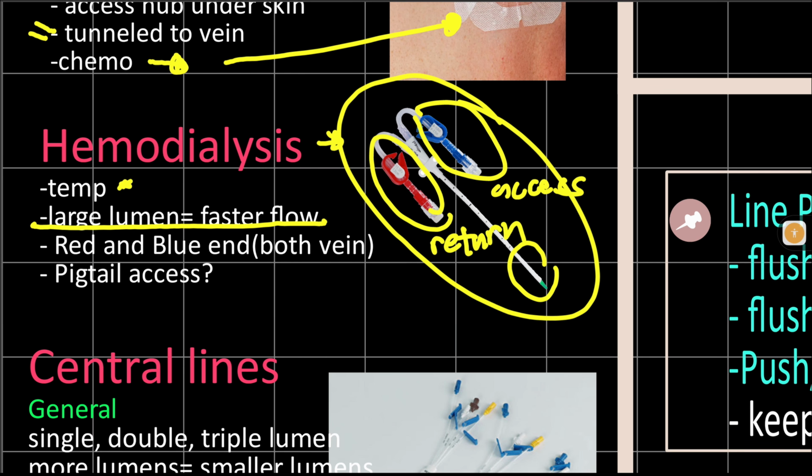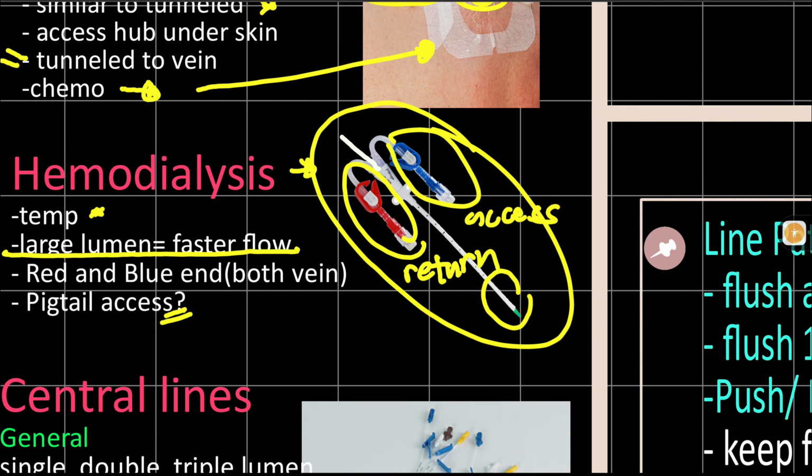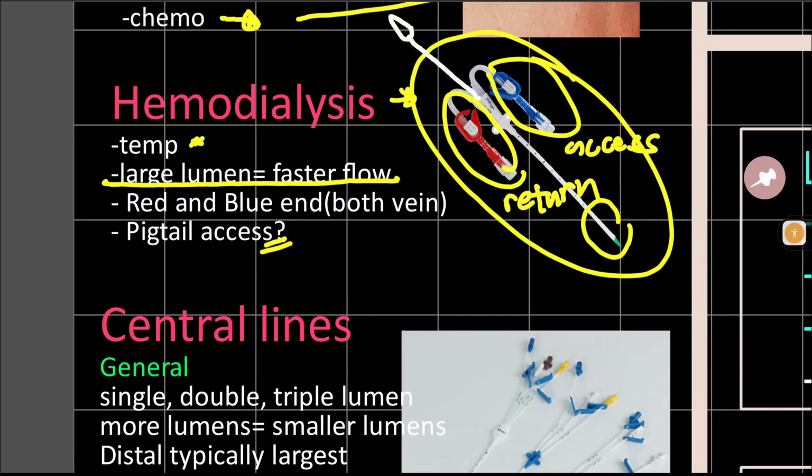Okay, so you will definitely check the patency before you start your dialysis in your CRRT. Now, in terms of pigtail, there's actually some hemodialysis lines that you will see with an additional port here for medication administration, or extraction of blood, or giving blood. It's actually provided, but for this one I have the classic one, the 2 ports. Okay, so are we good with your hemodialysis?